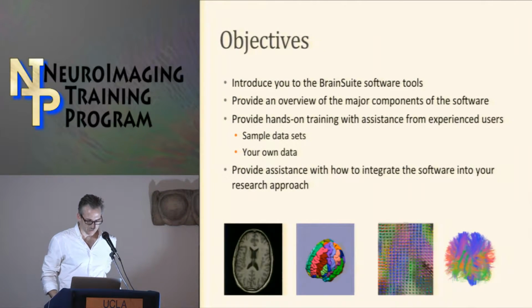We'll do hands-on training after I've described it in the presentation, so you can use the sample data sets we provided. And if you want to try out some of your own data, we'll stick around for most of the afternoon. My research assistant is here as well, and we have another person from our group that'll be joining for the labs to help show you how to use the software.